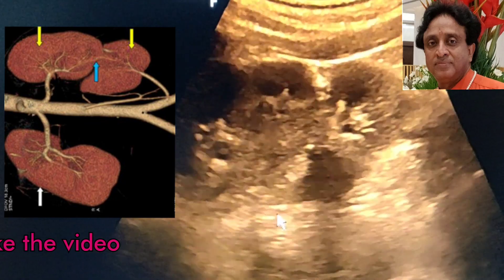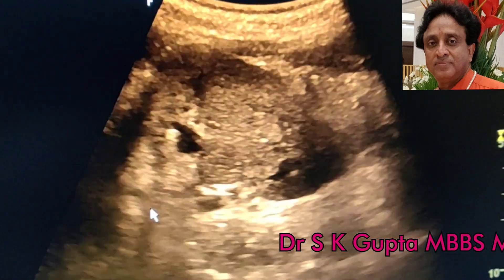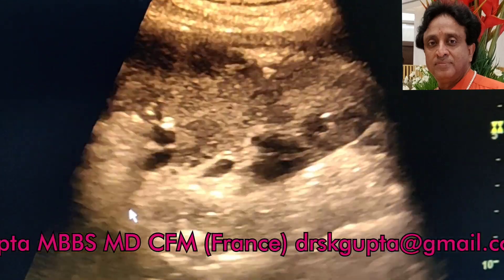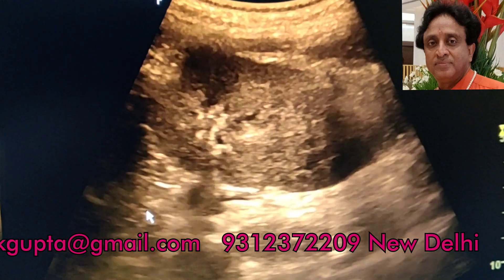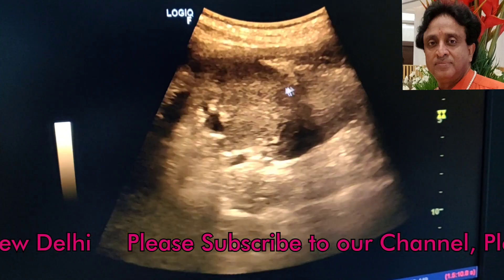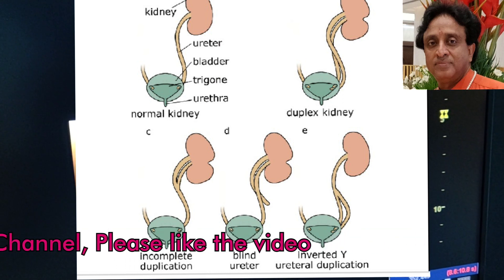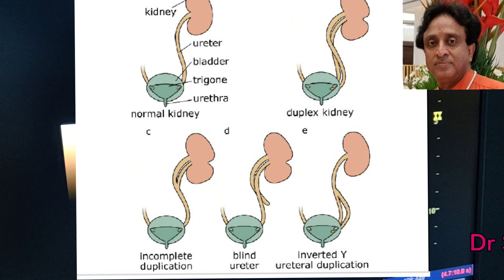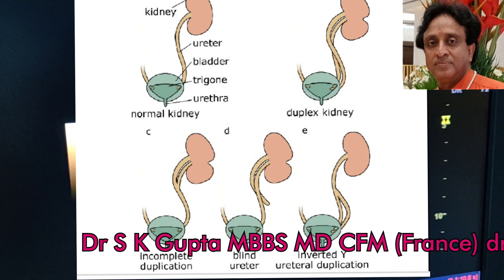The differential diagnosis in this case can be the duplex kidney. The difference between the supernumerary kidney and the duplex kidney is that the supernumerary kidney will have its own separate capsule and both kidneys will be divided by the capsule, and they will have different blood supply and a different ureteric system. The duplex kidney, on the other hand, will have a single capsule with two pelvic collecting systems, and can have a separate, fused, or bifid ureter, but the capsule and blood supply remain the same. The main differentiating point is that the supernumerary kidney will have a separate capsule.